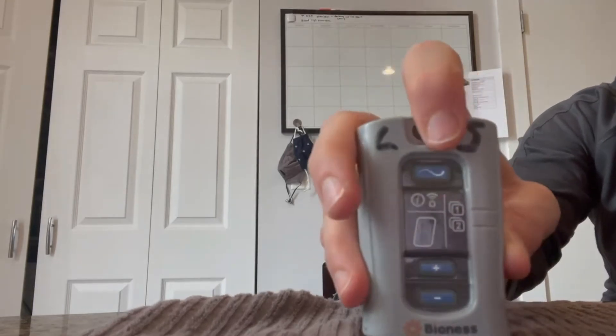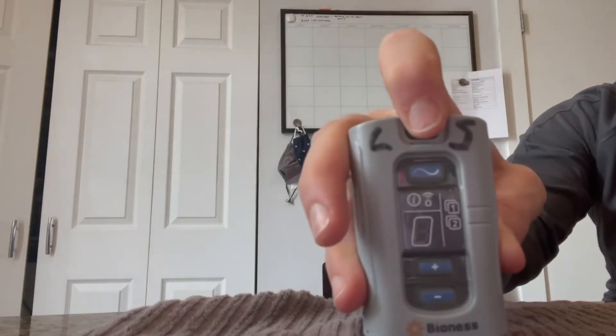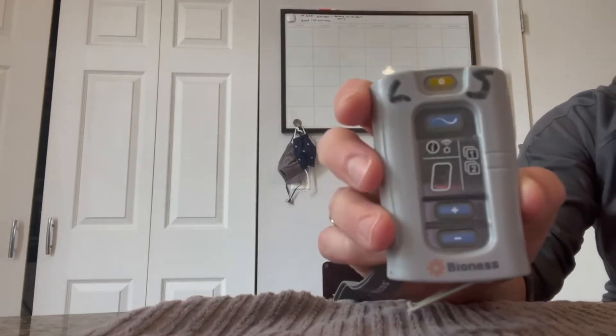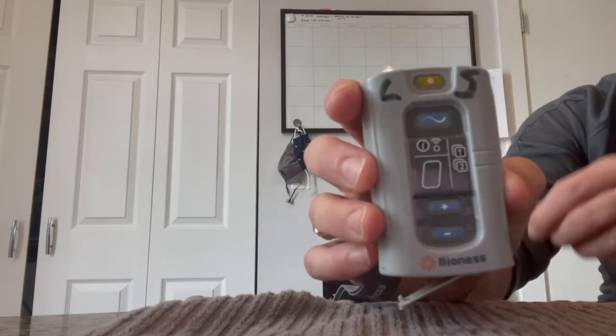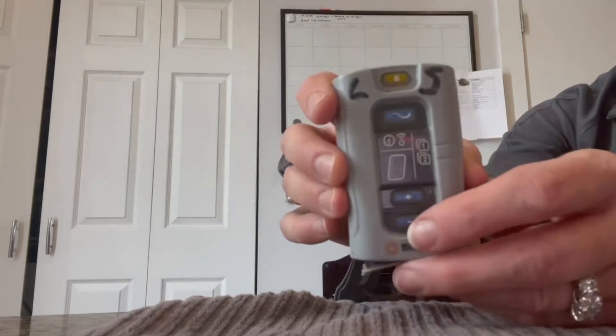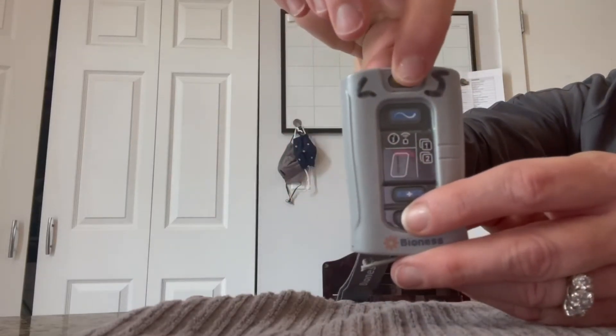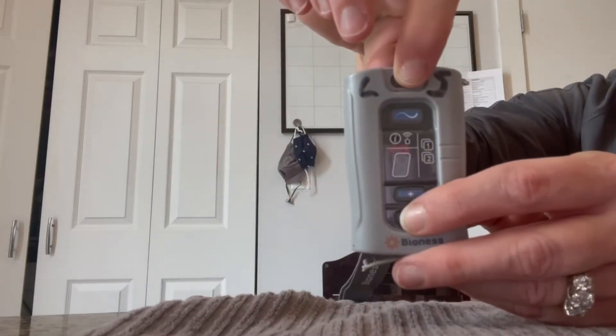We're going to shut the control unit off using the power button. We're going to turn it back on by pressing the minus and the power button simultaneously.